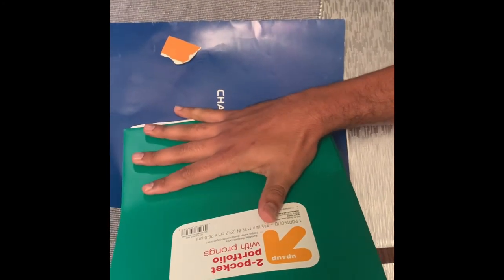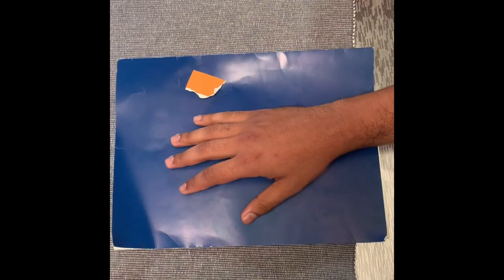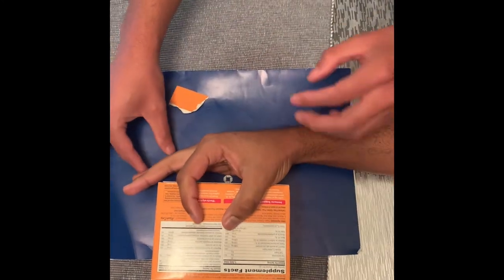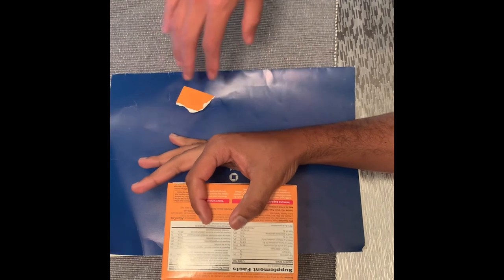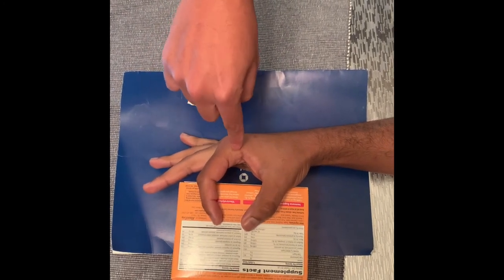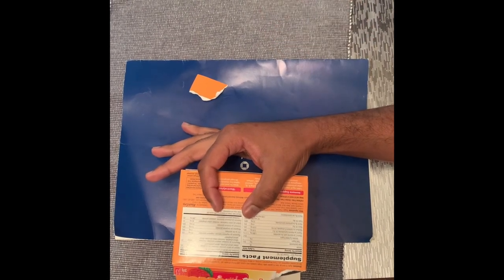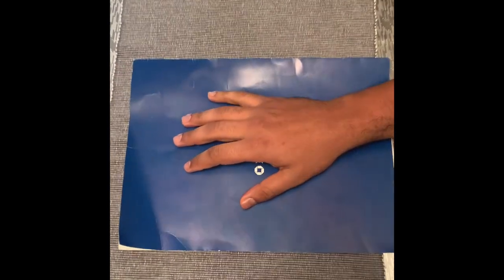Don't move — click — perfect, relax. The third view is going to be the lateral hand. I need you to put your hand like this. We're going to need another device to place the fingers. The central ray is going to be perpendicular to the metacarpal joint. The anatomy demonstrated is going to be the hand and wrist in lateral projection — the phalanges, metacarpals, carpals, and distal radius and ulna — which should be seen without superimposition. Don't move — click — perfect.